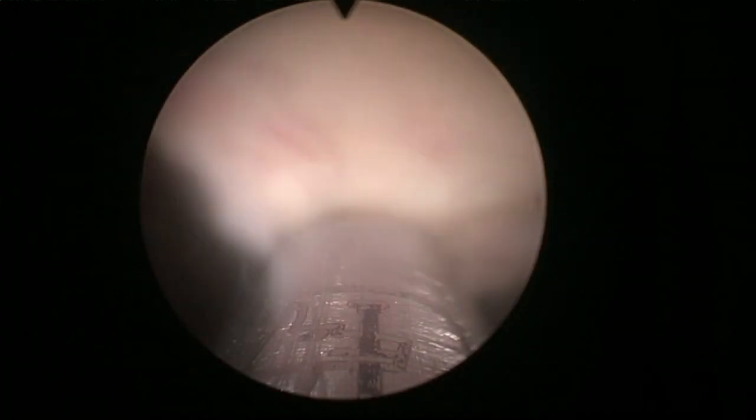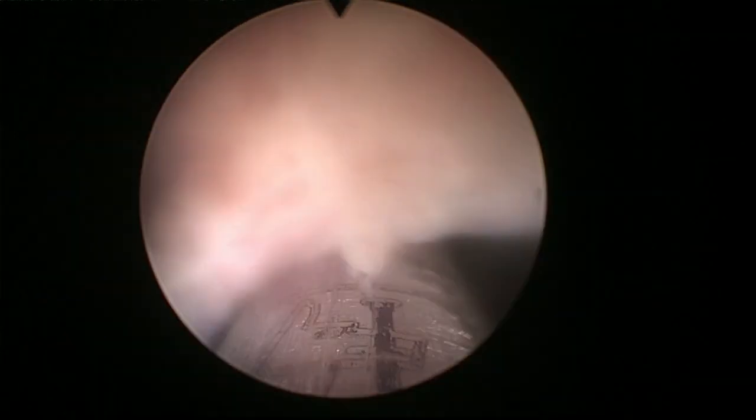This morcellation with the Piranha system is amazing because it's pretty fast. If you think about it, I'm just still in the middle of the bladder and the tissue is coming to the blade, so I don't need to move, I don't need to fish very often. When morcellation is efficient like this, it's wonderful. I don't use the second inflow like most people do, but I am very careful of the balance between water going in and water coming out.